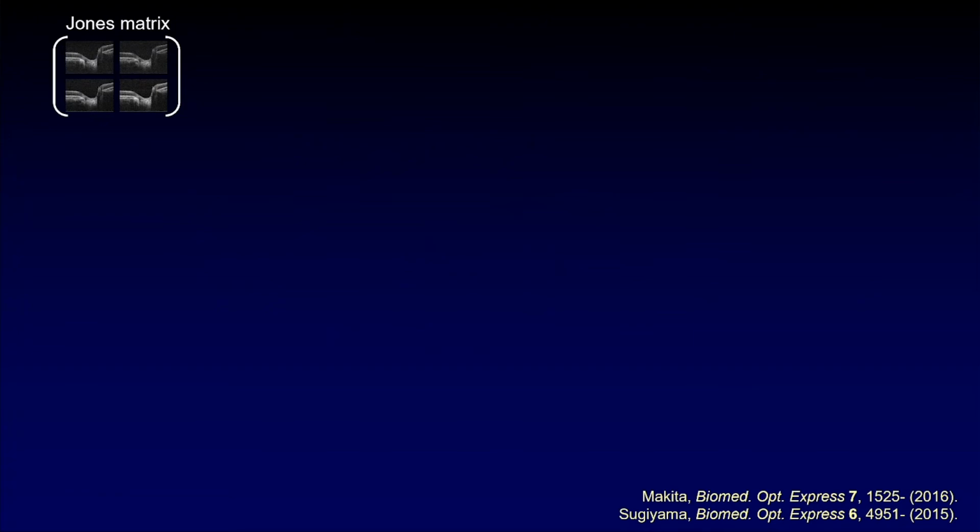And then the conception of the Jones matrix OCT is to measure the three-dimensional distribution of the time sequence of the Jones matrix. There is the time sequence of the Jones matrix. It's a one-dimensional property along the time axis, and each Jones matrix has 4 complex entries. Okay, so there are 8 parameters, 4 times 2, real and imaginary.